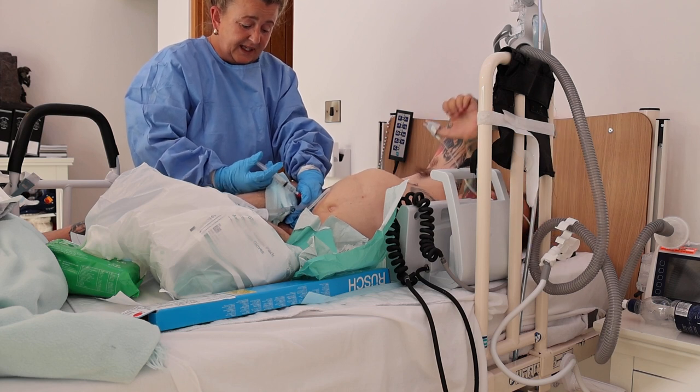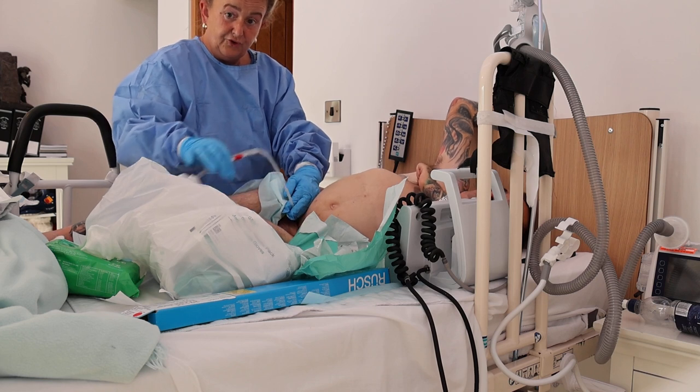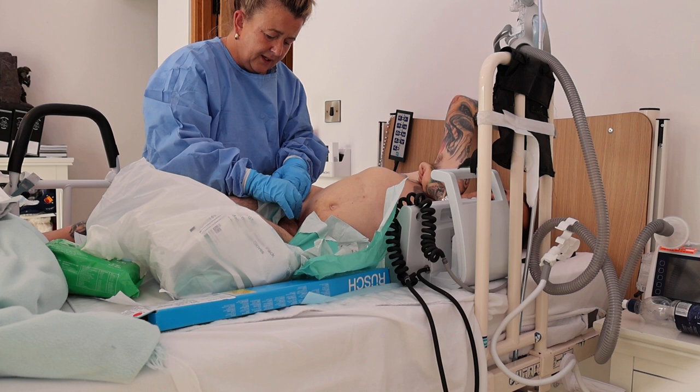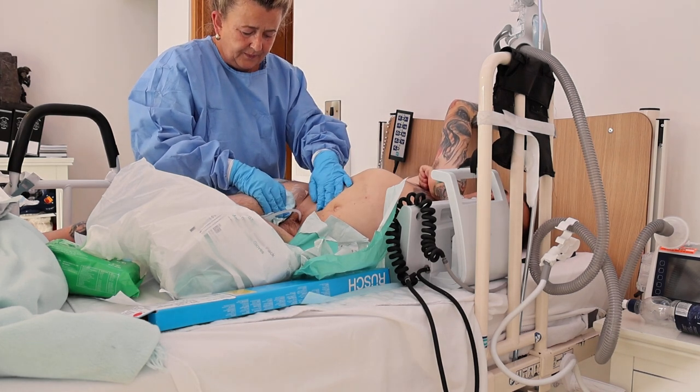And I do it quick. Lots of people do it slow. That's the balloon in. Drop your catheter down, and then take a little tug. Only tiny. And make sure it's in situ.